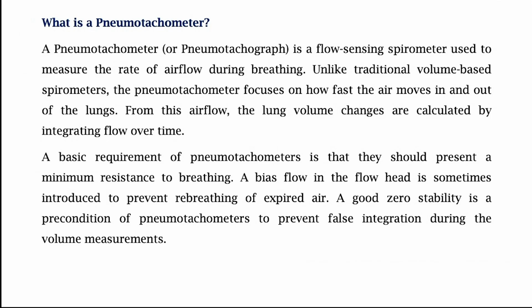This is the principle of measurement of the pneumotachometer. These are essentially flow sensing spirometers that measure the rate. That is not the volume. The difference is that the spirometer measures volume, whereas pneumotachometers measure flow, which is the rate during breathing.